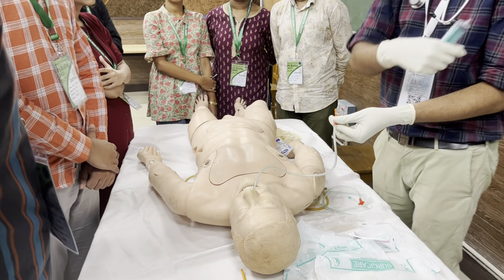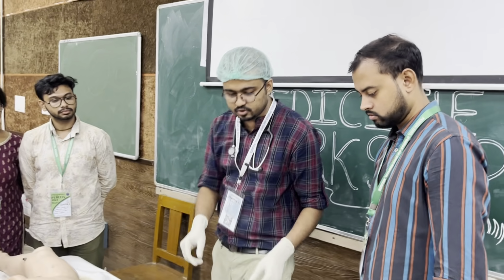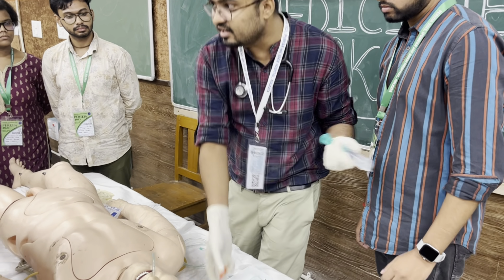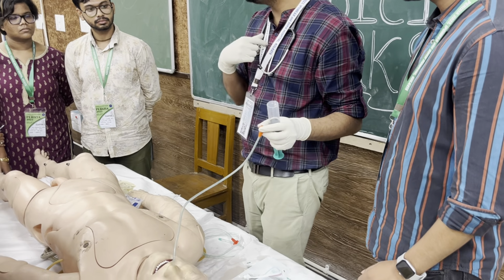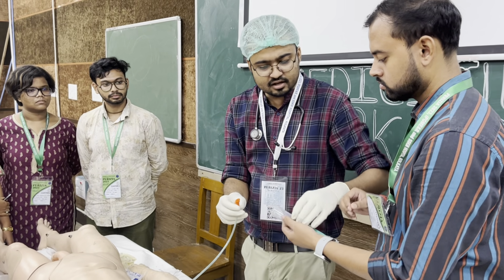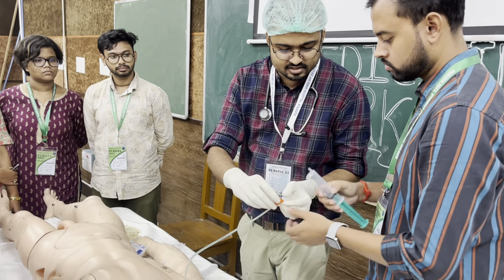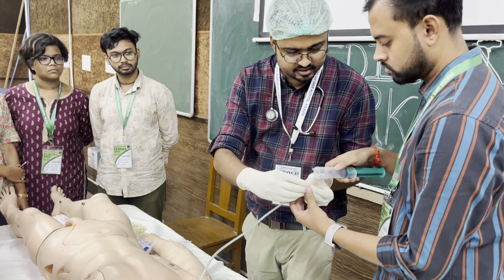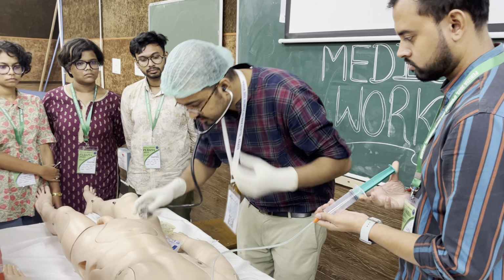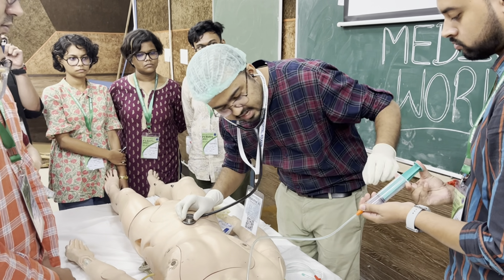I need one assistant. Come here. So the third one is by auscultation method. He will push some amount of air through this passage, and I will hear the sound in the epigastrium, in the stomach. So when I ask you to push the air, you will push. Just connect it here. Connect it. So I am placing the stethoscope over the stomach. Push. Fast. Yes.